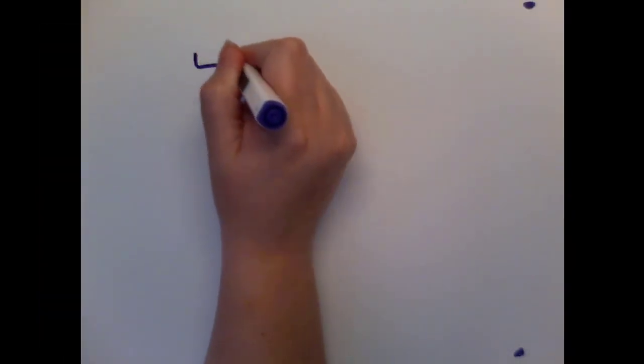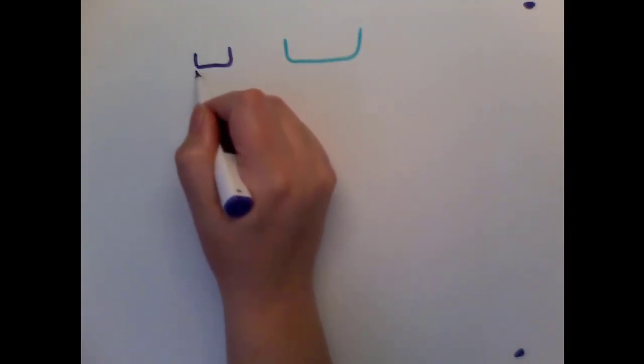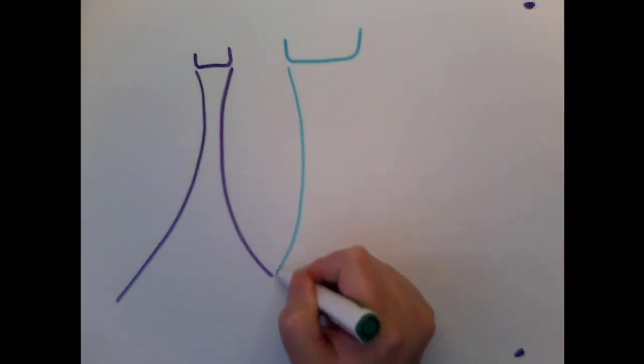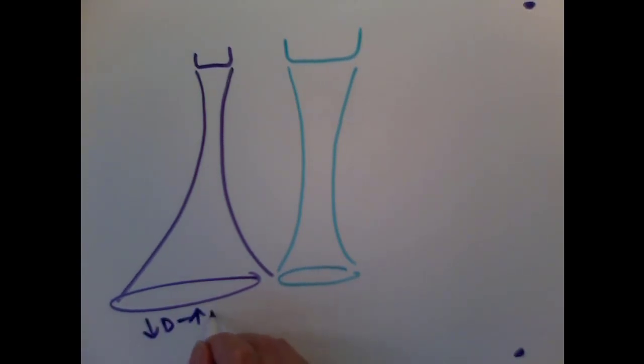So let's take a look at this. Again, we have a small crystal and a large crystal. And we're talking about the divergence that happens in the far field. So the small crystal is going to narrow and then diverge a lot in the far field, where our large crystal is going to do very little divergence. Look at the difference between the two. Large crystals diverge less, where our tiny crystals diverged a lot. So, small diameter equals large divergence. Large diameter equals very little divergence.